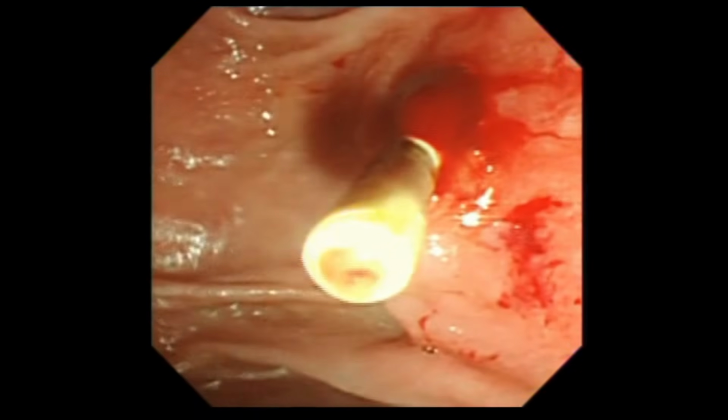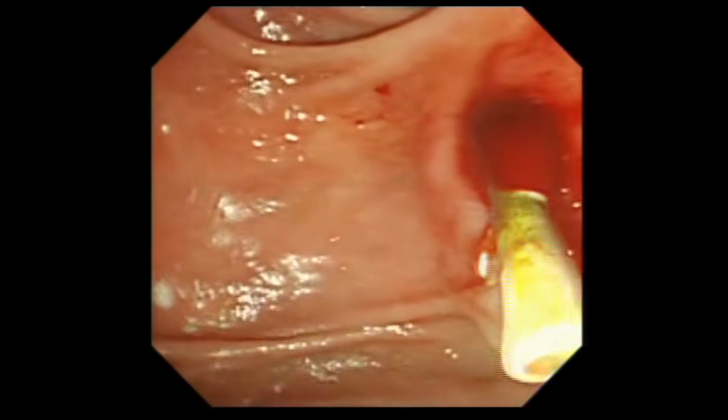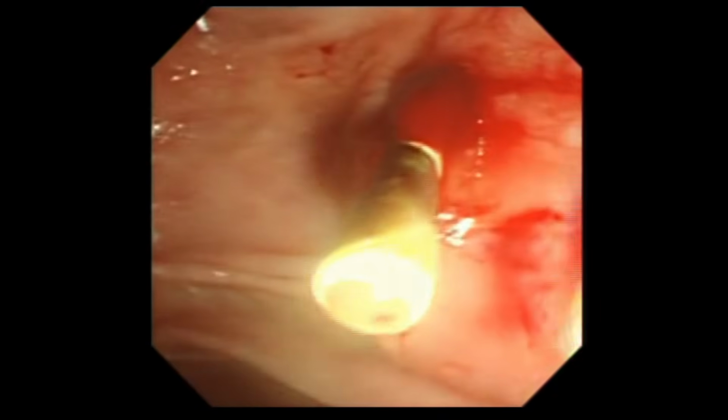Once the stent is in the duodenum, it is retrieved with the help of a snare. Care must be taken when snaring the stent so as not to catch the adjoining duodenal wall or a part of the papilla within the snare.